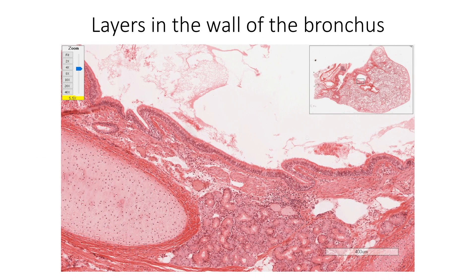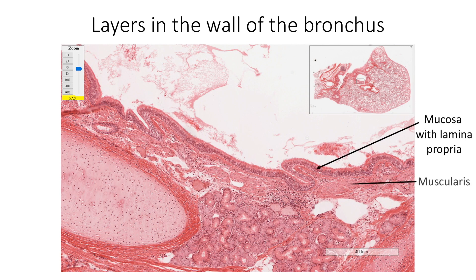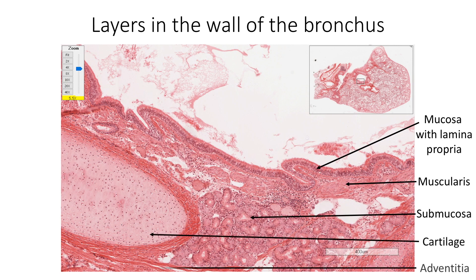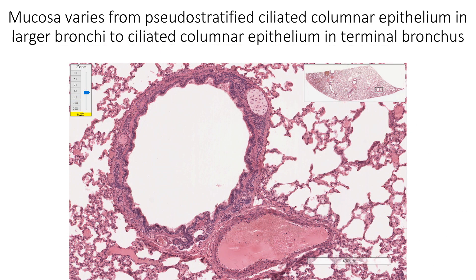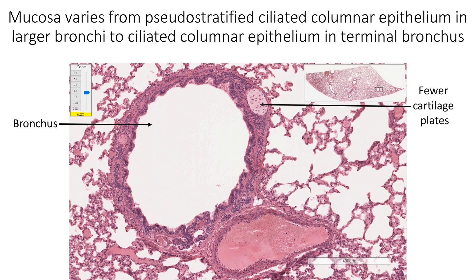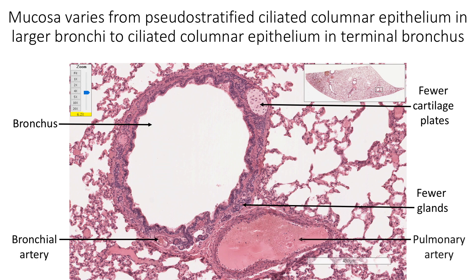From inside outward, the wall of the bronchus shows mucosa with lining epithelium and lamina propria, muscularis with smooth muscle, submucosa with seromucous glands, hyaline cartilage plates, and an outer layer of adventitia. Mucosa varies from pseudostratified ciliated columnar epithelium in larger bronchi to ciliated columnar epithelium in terminal bronchus. The smallest bronchi show folded mucosa resulting in vertical ridges, fewer cartilaginous plates, and fewer seromucous glands in the submucosa. We are also able to see the bronchial artery in the wall of the bronchus and accompanying pulmonary artery.